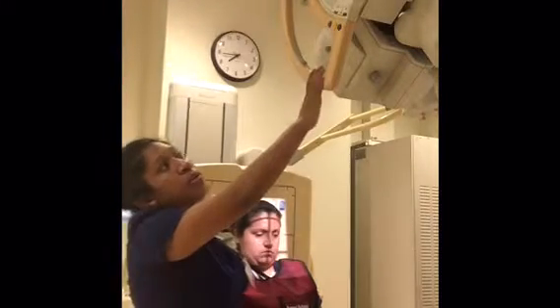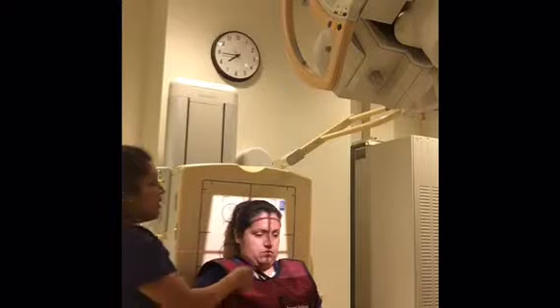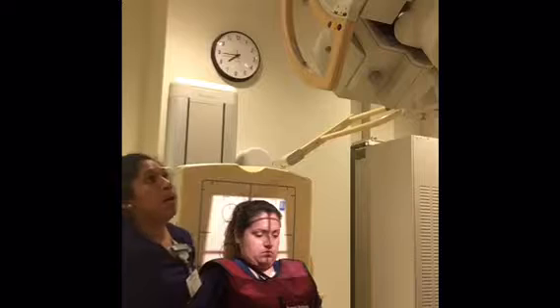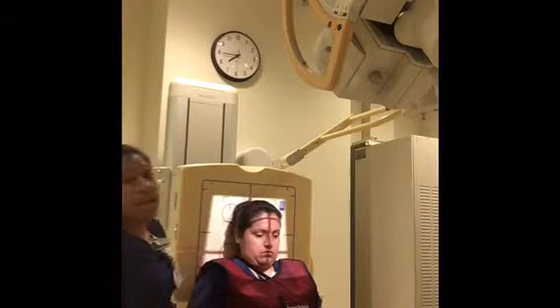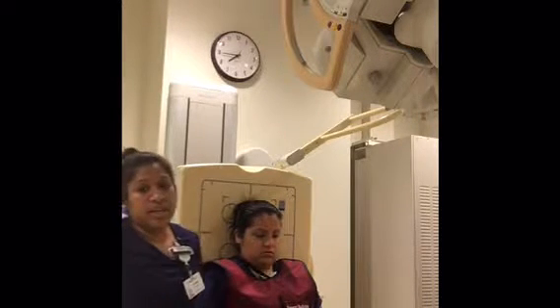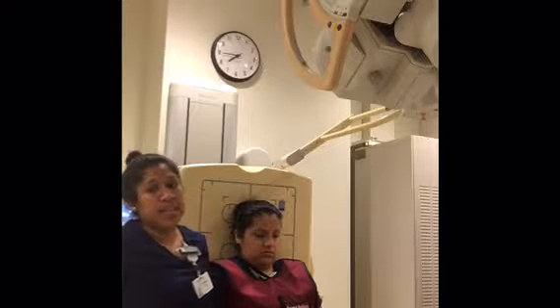So we have our tube that it is at 30 degrees. We have our central ray 2 inches above the glabella, and the OML is perpendicular to the IR, as you can see that. And then we have our patient shielded, and then our technique that we're going to use is 85 at 14 through 16 mAs.